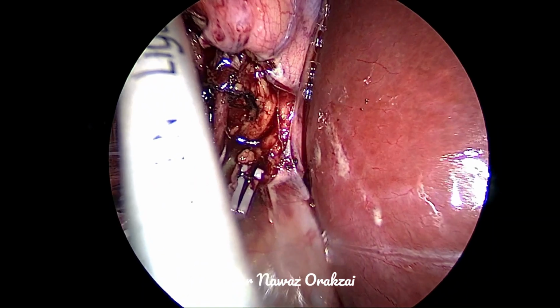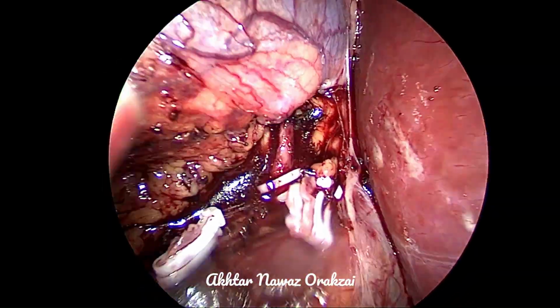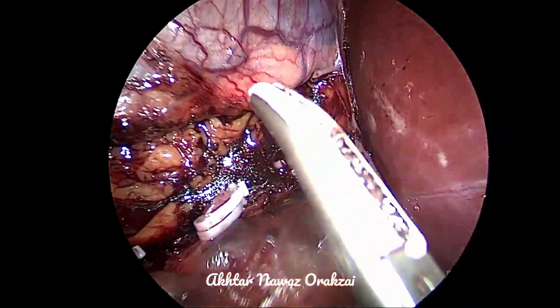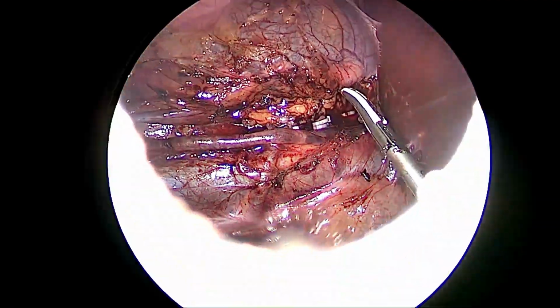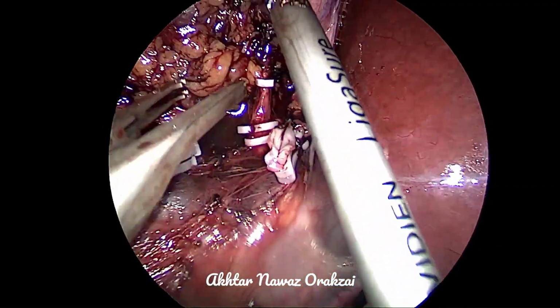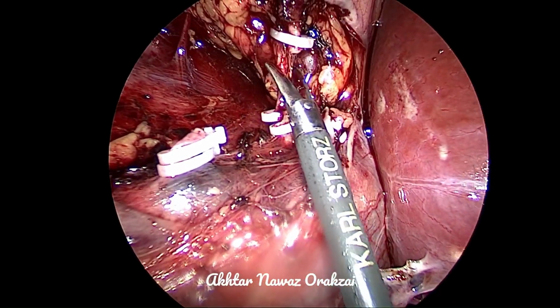You can see the vein, that there is a bit of lumen that we can see here. Yes, here, and there is a good stump. So if we cut near to the proximal clips, then there is a danger of slippage of the clips or the vein from the clips. So now the artery has also been completed, and we are cutting the artery near to the distal clips.